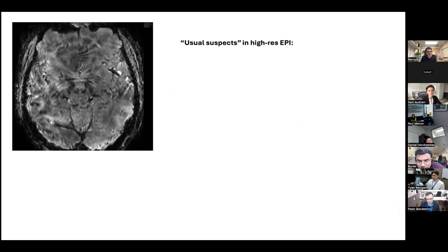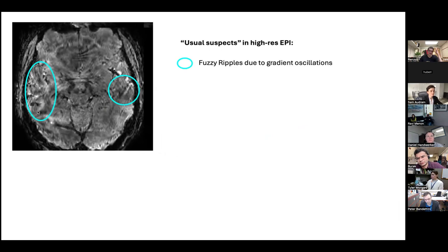And I think we can classify some of these issues. Basically, we see these low spatial frequency issues, these fuzzy ripples, as we call them, usually visible as low spatial frequency smooth darkenings or brightenings. Like we have 20 voxels in diameter that are darker, then 20 voxels brighter, darker, and this entire patch here is dark.